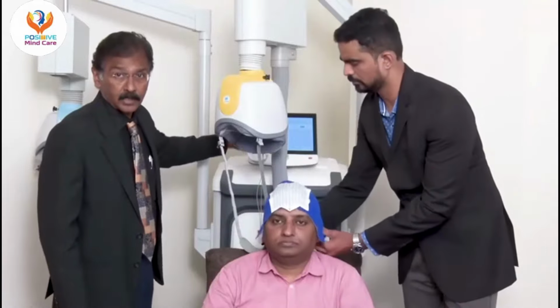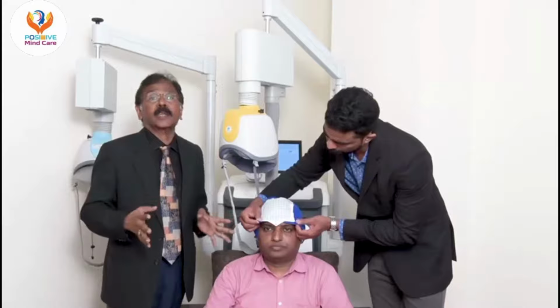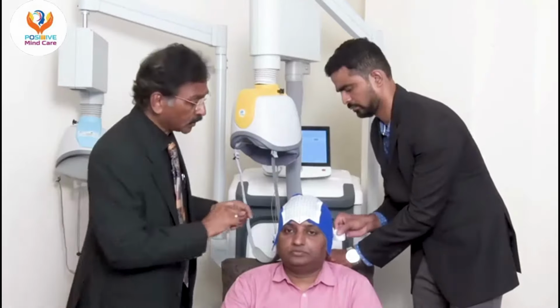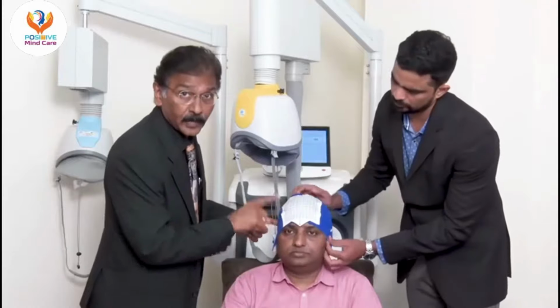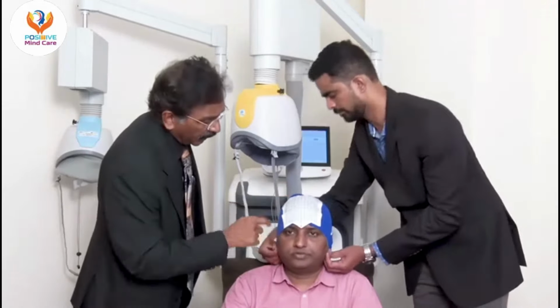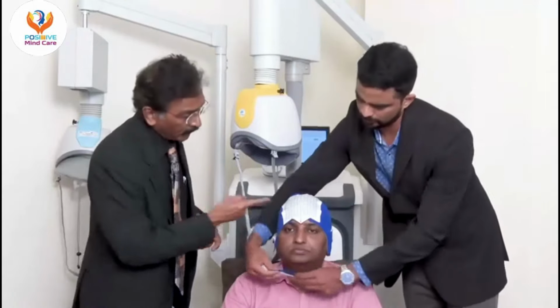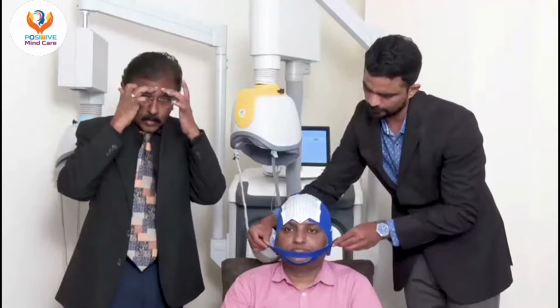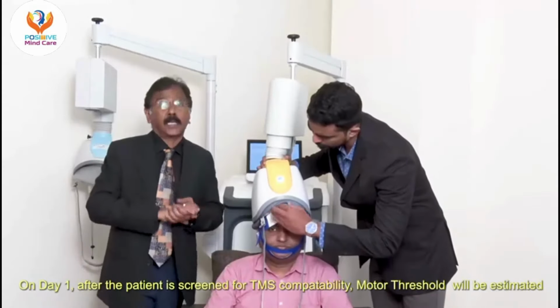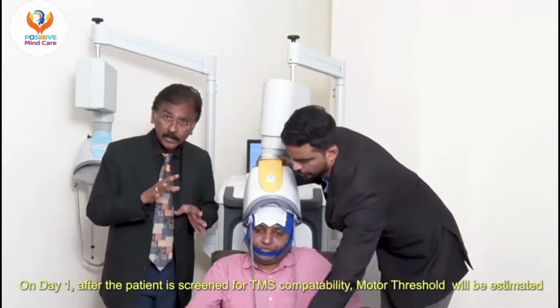Software where we can adjust the protocols. After the diagnosis of OCD, we do the screening so that he will be fit for this treatment. If you notice this, there is a grid here. If you see the grid, there are different lines, and there is one red line which we have to adjust exactly to the point of Nasion, and then the level 1 should not come down below the levels of eyebrows. On the first day, on the first treatment, we check for motor threshold.